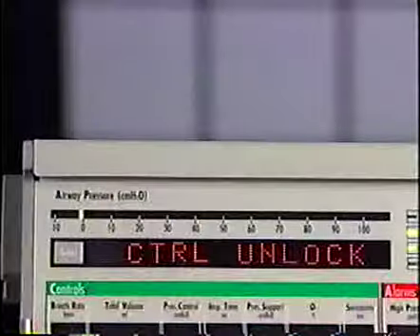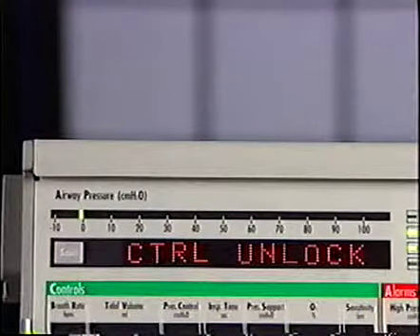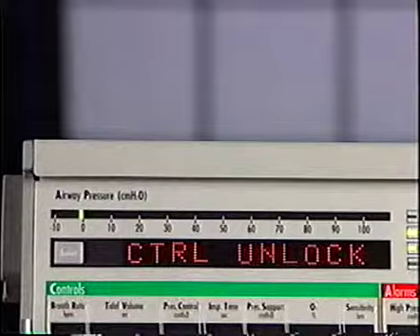The next ventilator operations menu feature is Control Unlock. This feature is used to select the easy or hard method for unlocking the controls. The easy method should be used when only trained personnel have access to the ventilator. The hard method should be used when children or others may have access to the ventilator and you want to prevent accidental changes to the control settings.